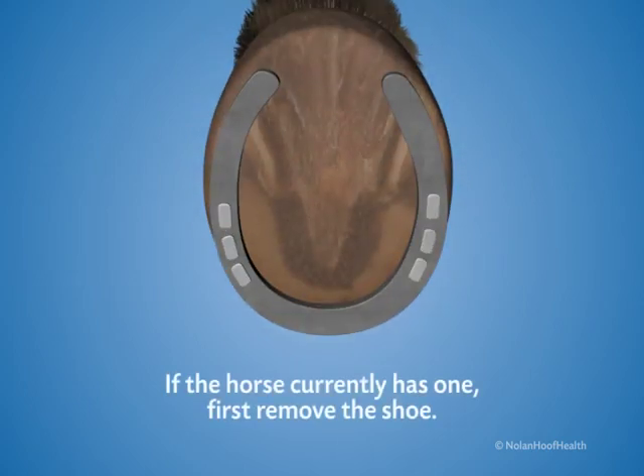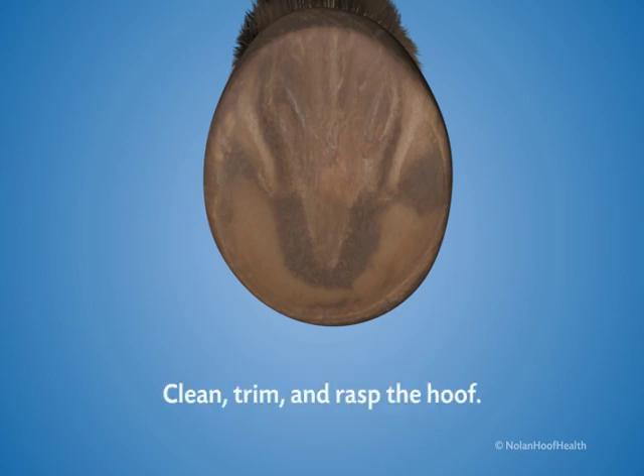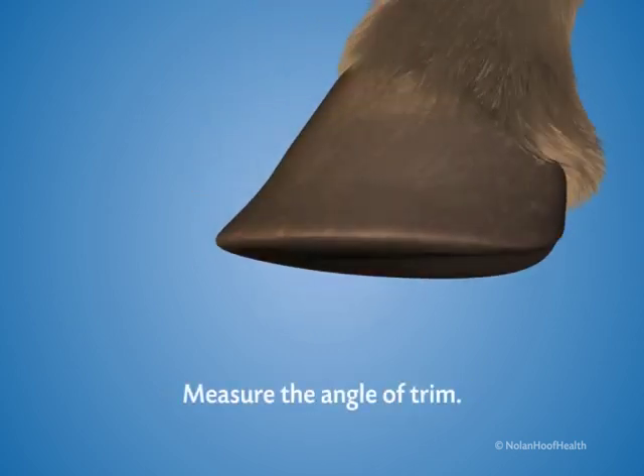If the horse currently has a shoe, first remove it. Clean, trim, and rasp the hoof. Measure the angle of trim.